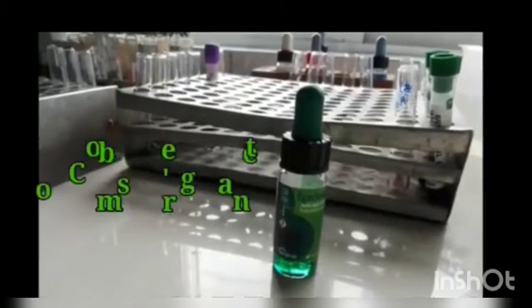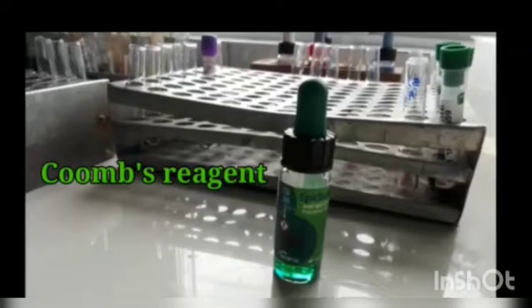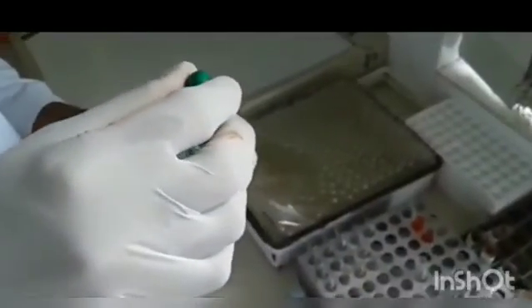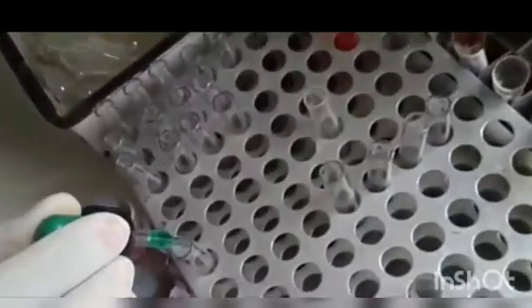Now we will use the Coomb's reagent. To the tubes that you have already labeled, we will put 2 drops of Coomb's reagent.